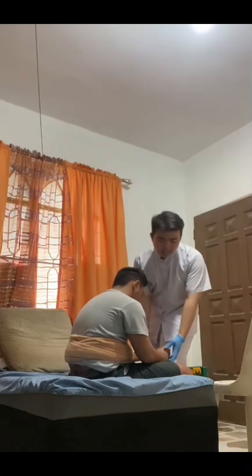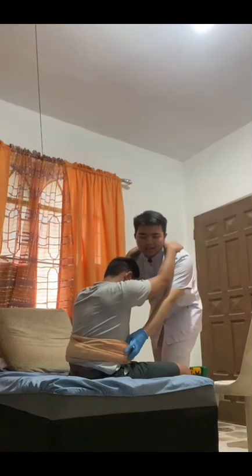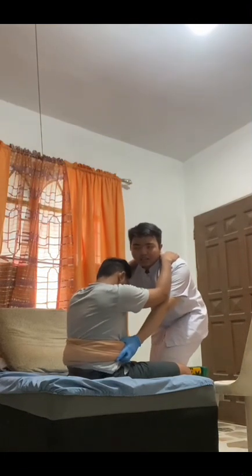Now that the towel is already secured around the waist of my patient, I am now going to put my legs in between my patient's legs so that when he stands and gets out of balance, I can support the patient and we won't go out of balance together. Now, I will ask the patient to hold on to my shoulder. Now, sir, in a count of 3, we will stand together nice and slow. 1, 2, 3.